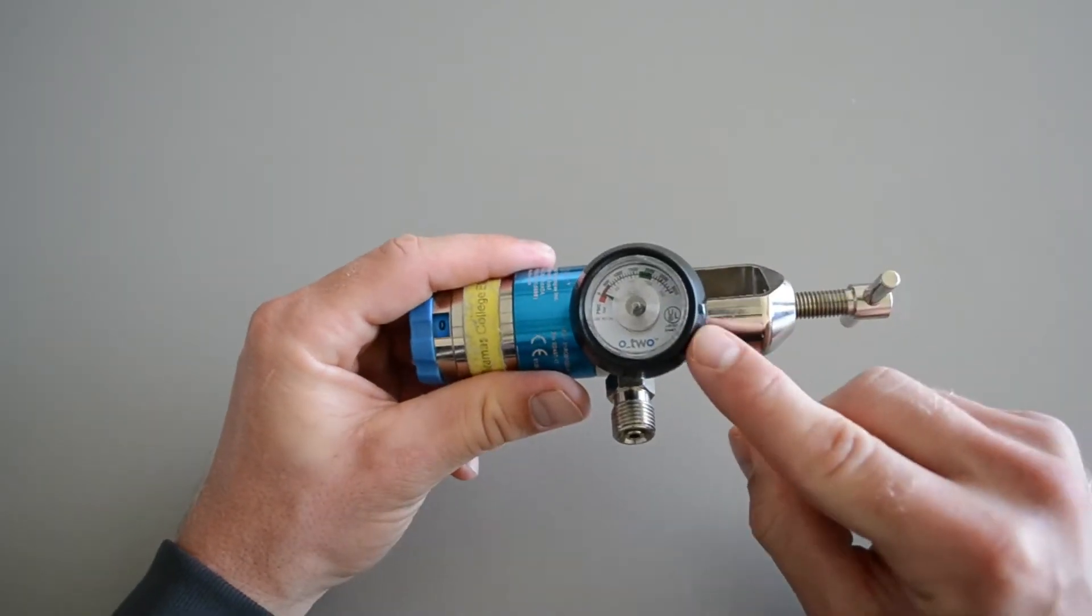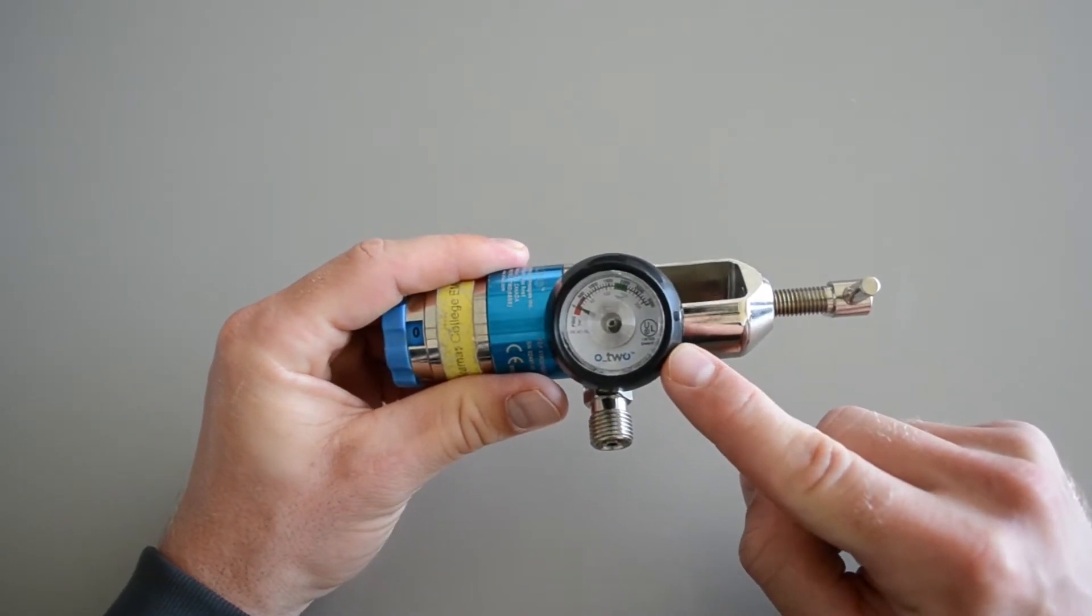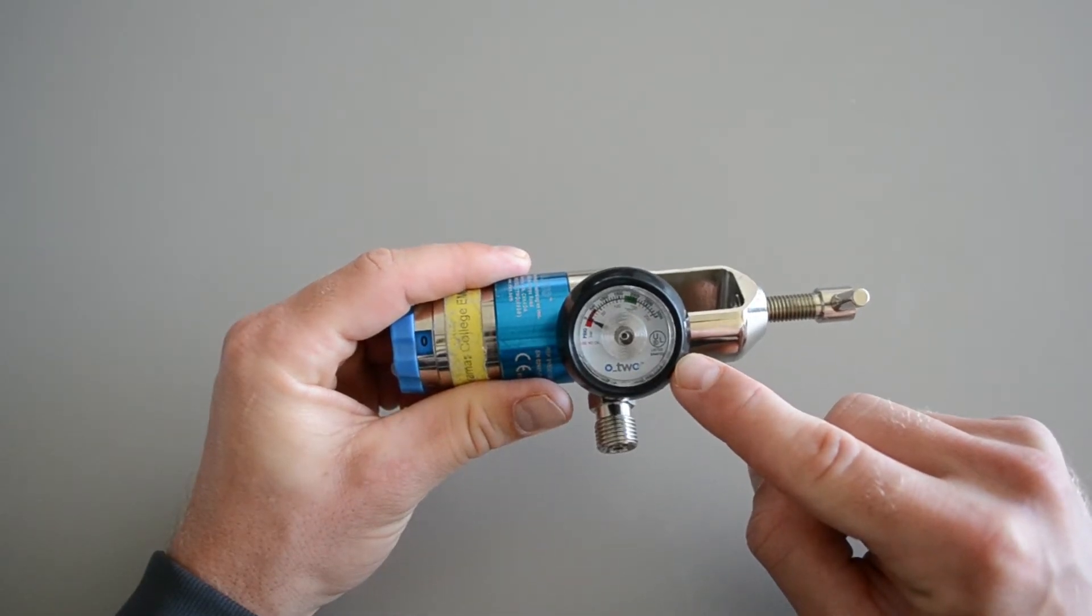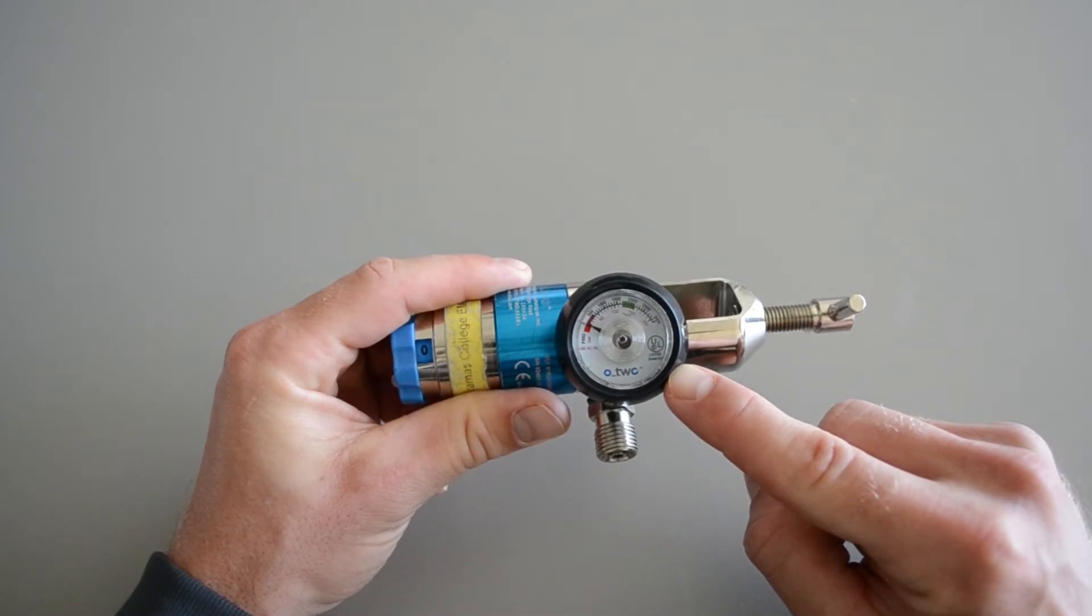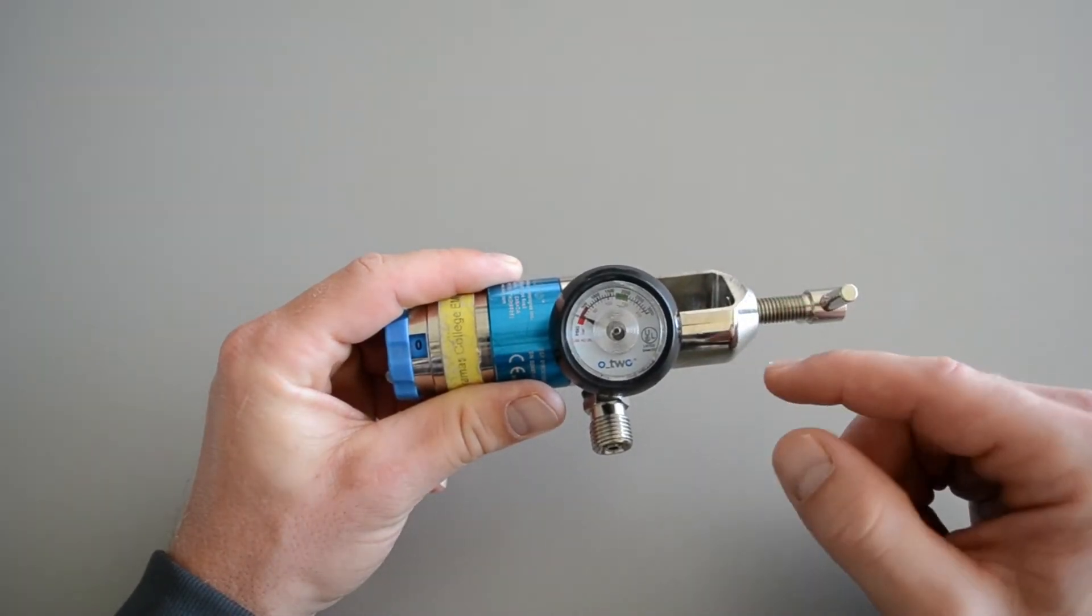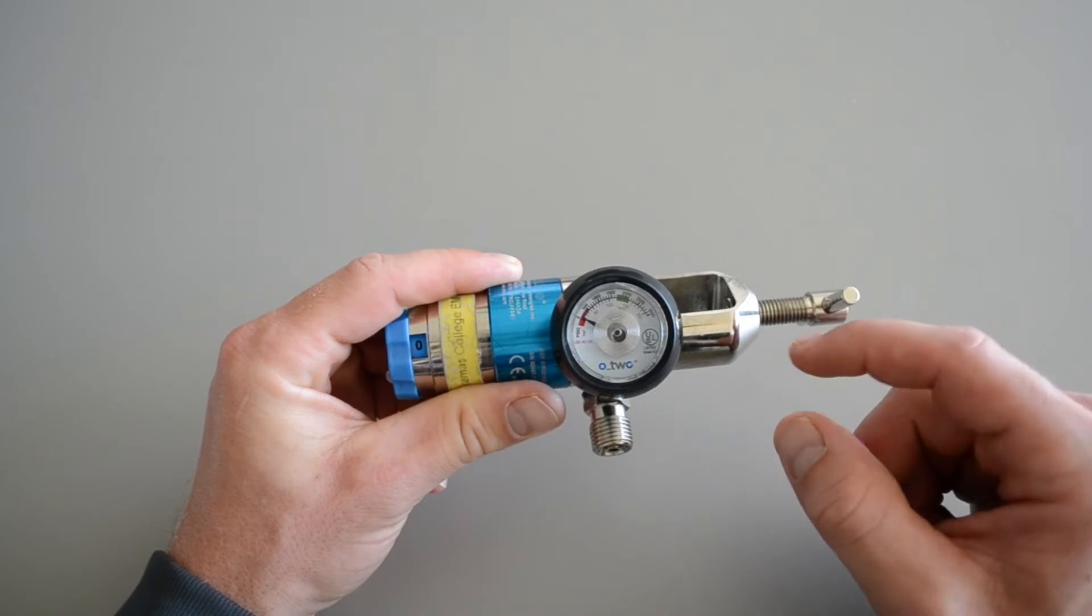Biggest components are this dial, this will indicate the PSI, pounds per square inch, that's present in the O2 cylinder. A full tank will read at 2,000 PSI, and in the field we typically change these out when it drops below 1,000.